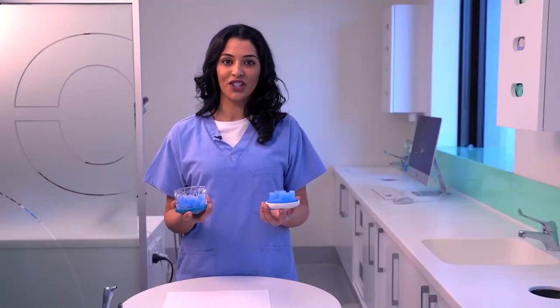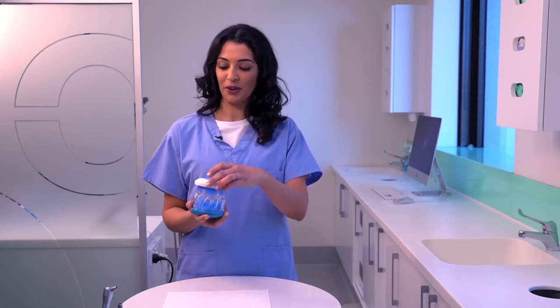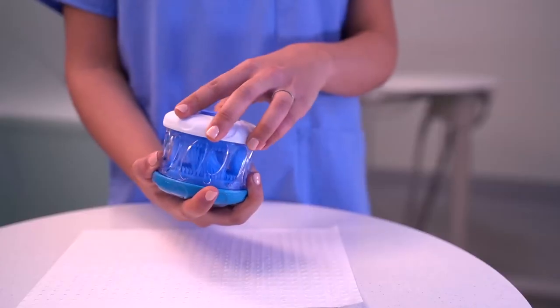To close your Dr. Marks Hygiene, simply place the white top handle onto the perforated body and turn until it clicks into place.